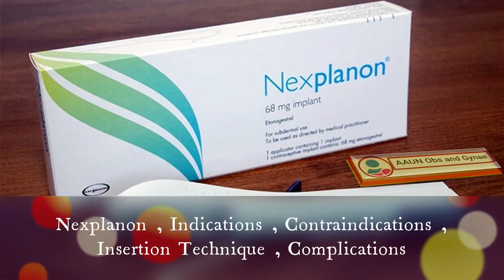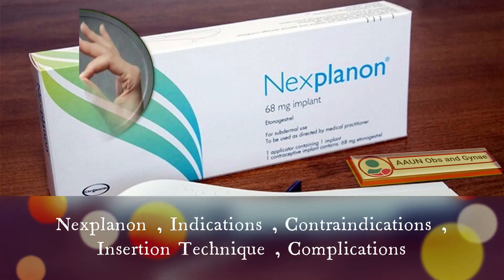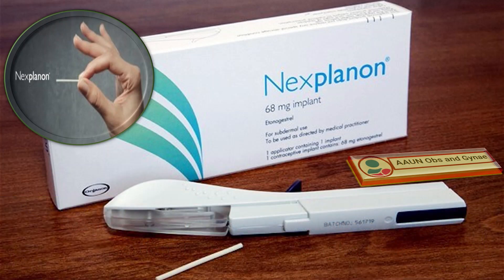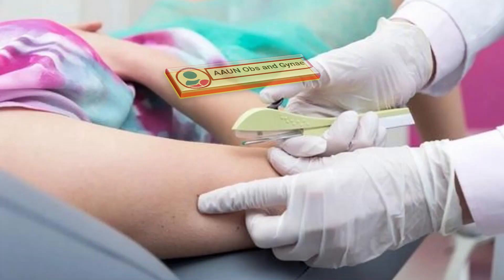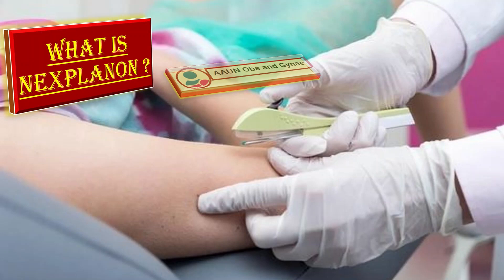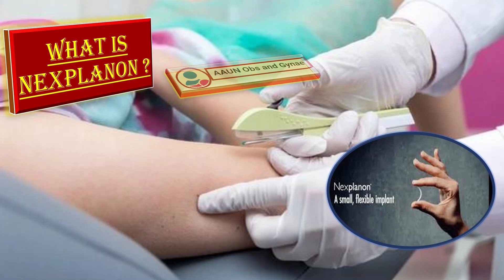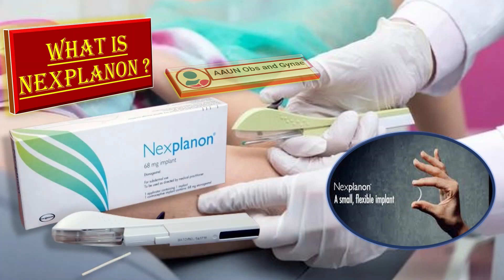Today we will talk about Nexplanon, which is a long-acting reversible hormonal contraceptive method. It is a small flexible birth control implant that is placed under the skin of the inner non-dominant upper arm. It releases about 68 mg of etonorgestrel over the duration of its use.